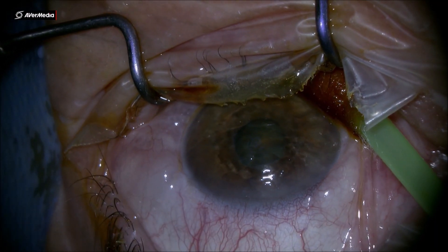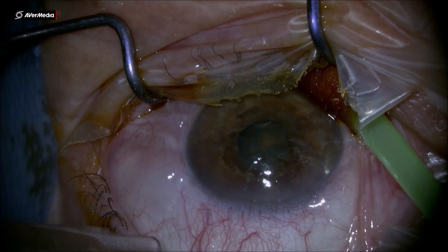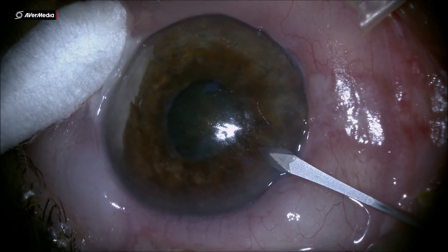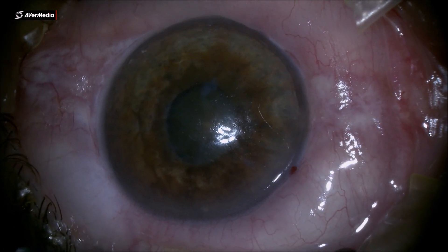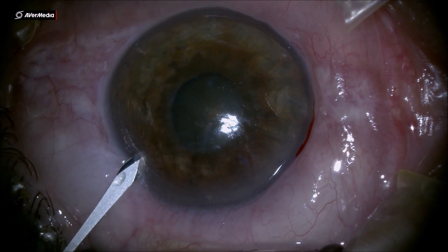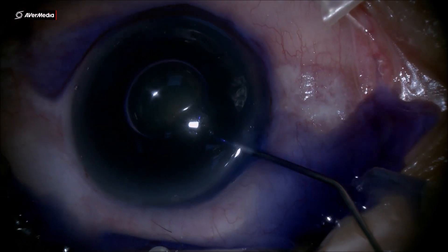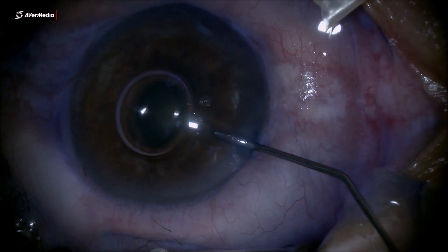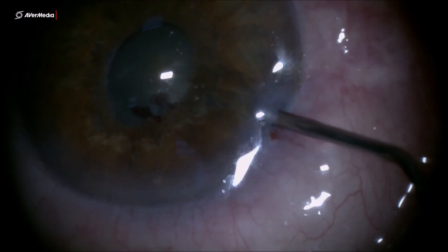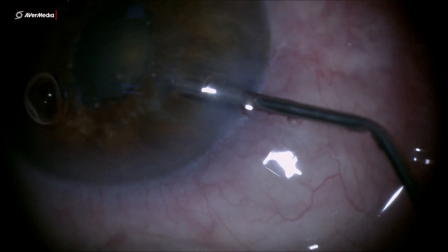Dear colleagues, this is a closed-angle neovascular glaucoma done in subconjunctival anesthesia. I have a pupillary membrane here which I'm trying to remove using two cross-action forceps, but it's a very thin membrane and very easy to break into small pieces.